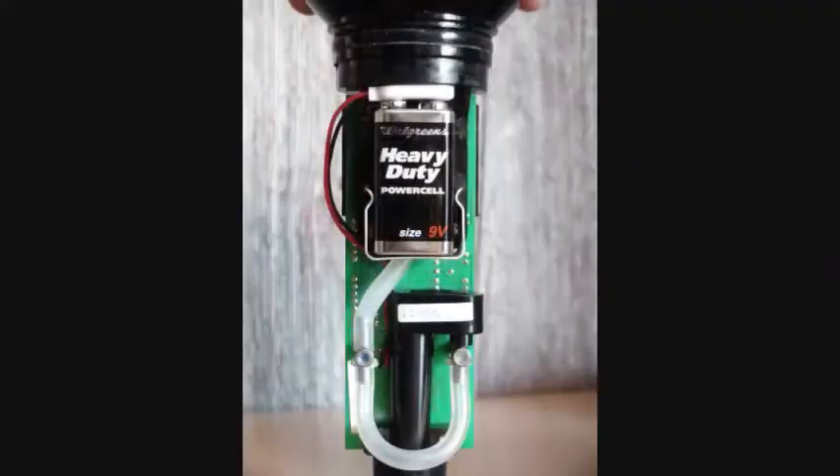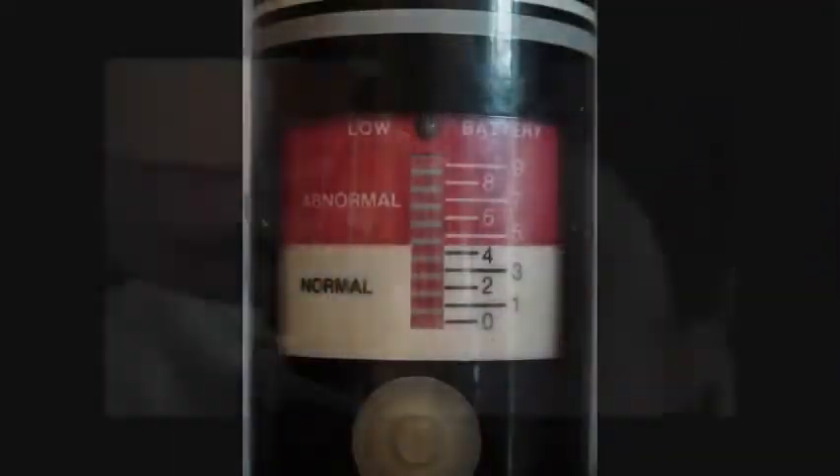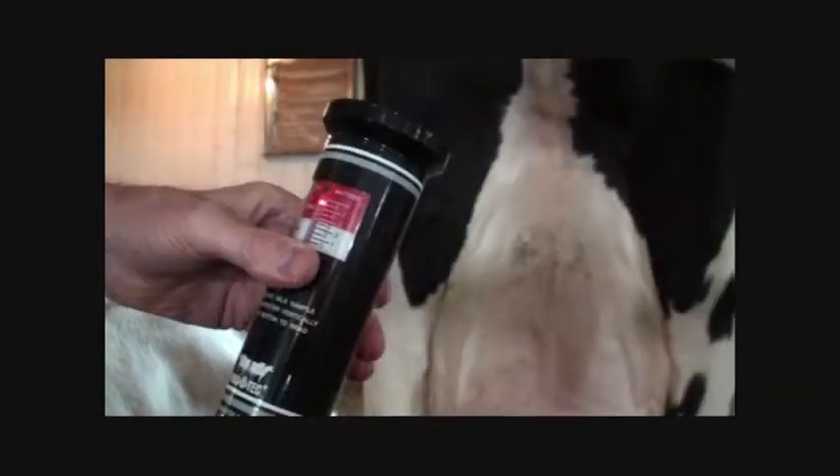The little battery in the back is good for 30,000 squirts. We're actually measuring salts in the milk — the higher the salt content, the worse the problem is. It's calibrated from zero to nine, and up to four is a good, clean reading. After that you're in the red zone, and when we're using Outer Comfort we treat every quarter that's in the red zone.